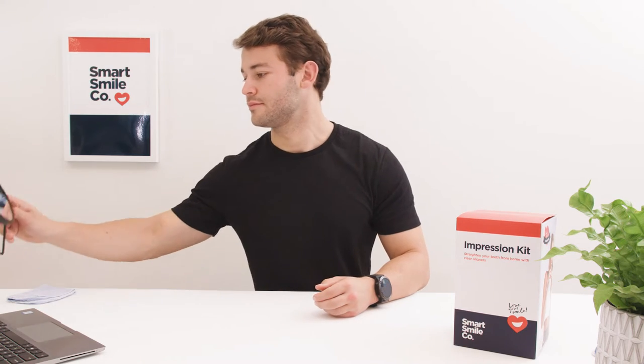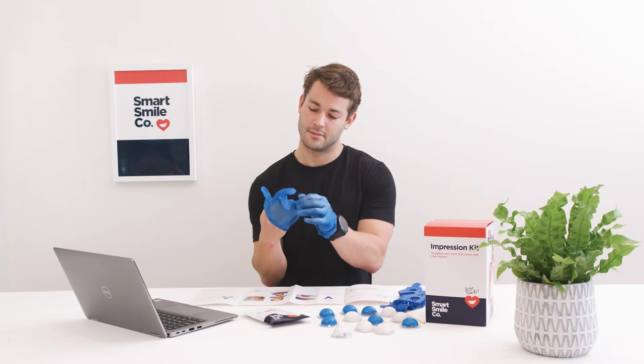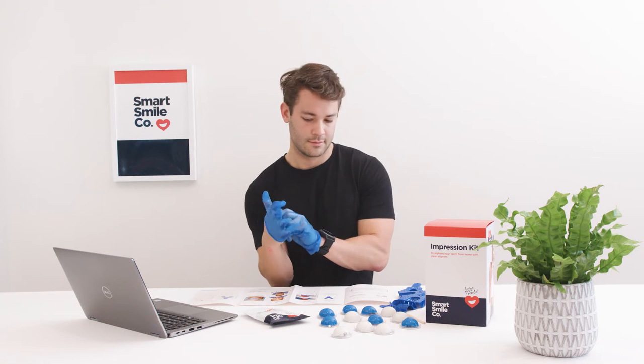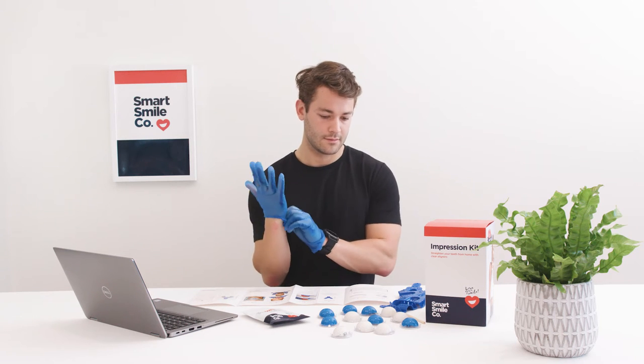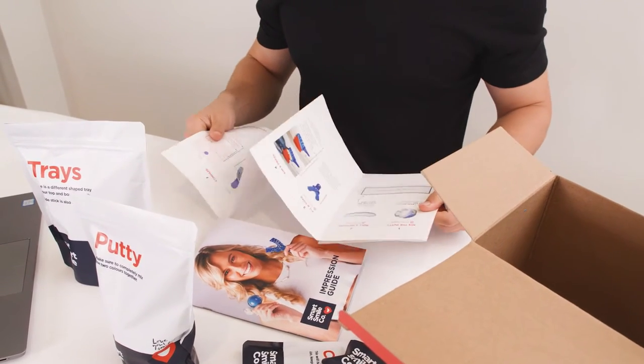Remember, brush and floss your teeth before you start. Have a tissue handy as you may dribble, and have a mirror handy. Wear the gloves provided — don't use your bare hands or other gloves as they may damage the putty. Lay out your fold-out guide and follow it through as you watch this video.